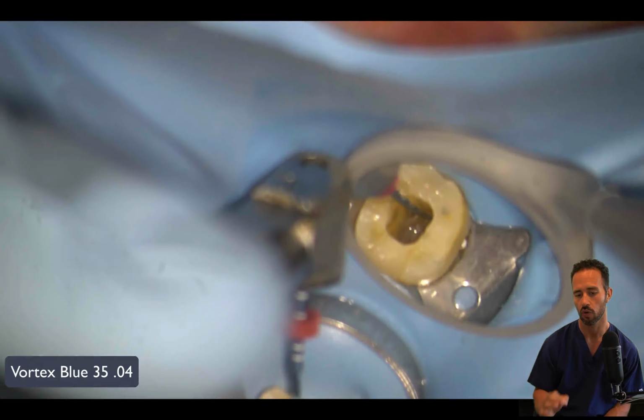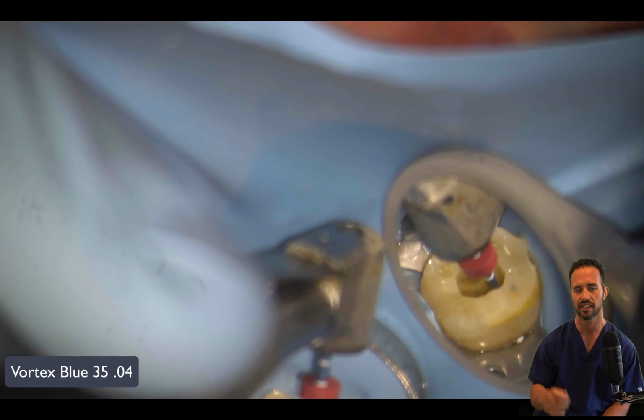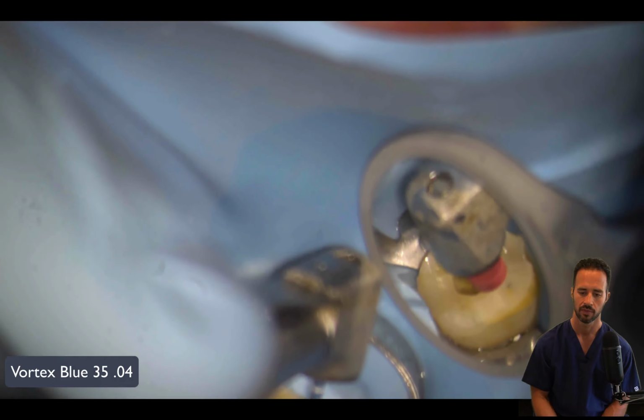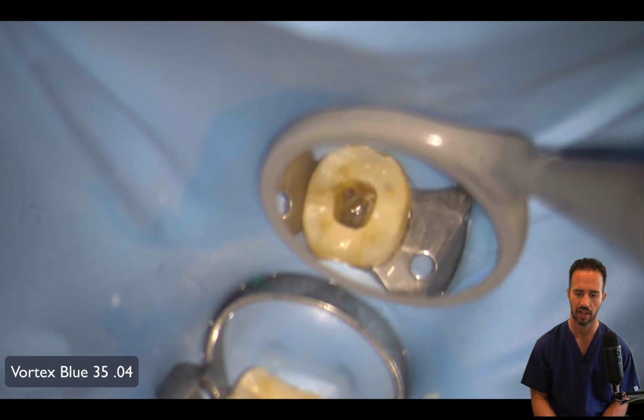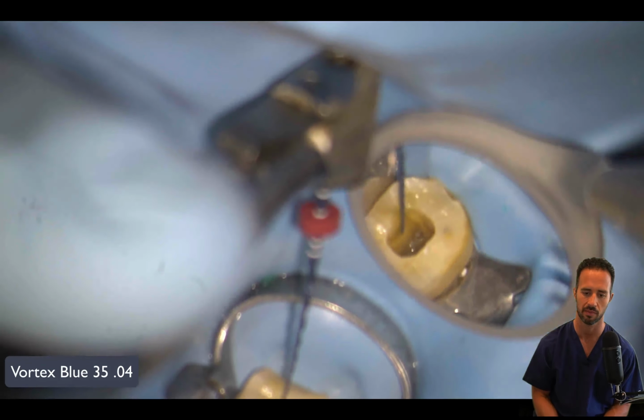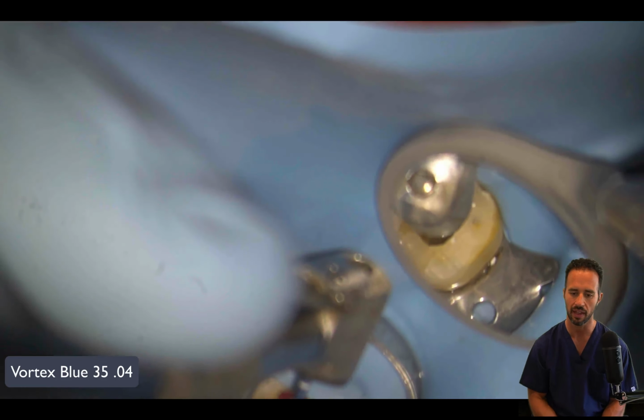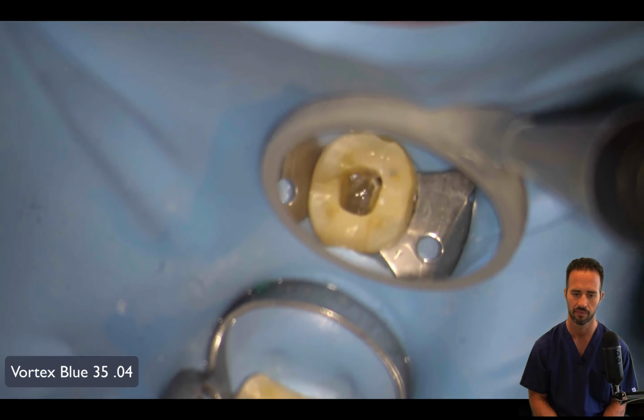Now we're going to go ahead and get our 35/04 rotary, just like I mentioned to you, and take that to length in every single canal, all 4. So there we have it, 20.5 in the MB. You can see that there's some calcium hydroxide on the file as I withdrew it from the canal. And then our ML, 20.5.